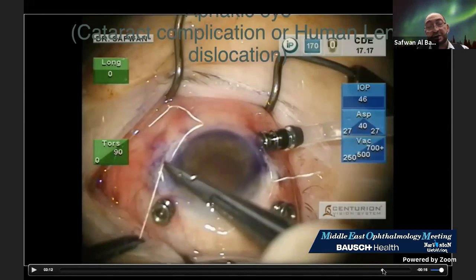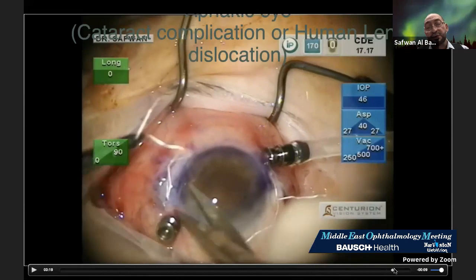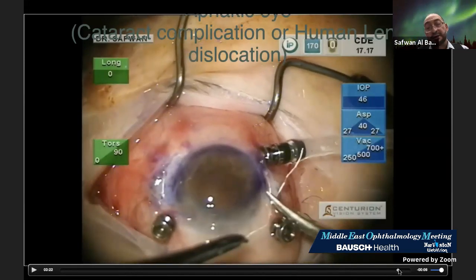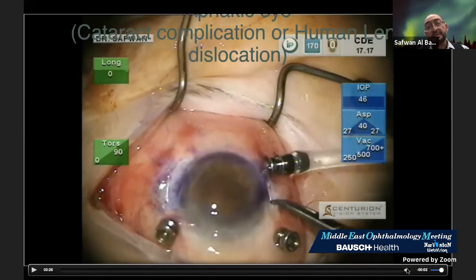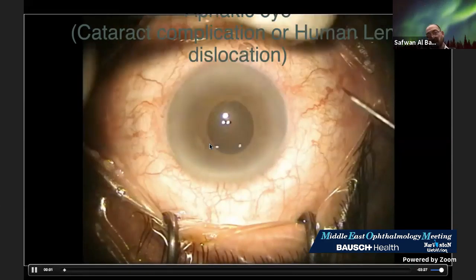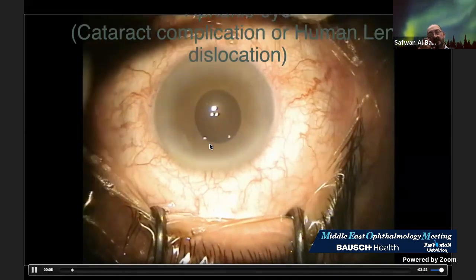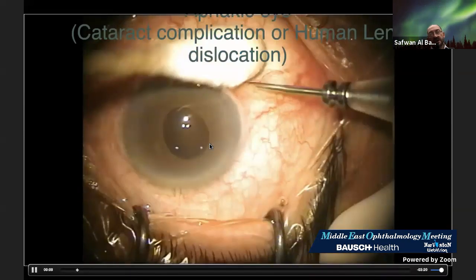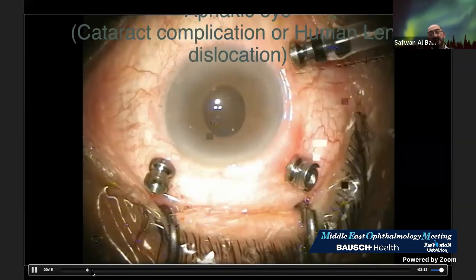So I can finish here tying, and then cut all the sutures, trim them, and bury both, and then close the conjunctiva. Now, I think I have the right to return it back, and it will be a very quick movie. And you can see the tips that I mentioned. This is a vitrectomy. We can skip this side, and you can see the sclerotomy, sorry, the peritomy.